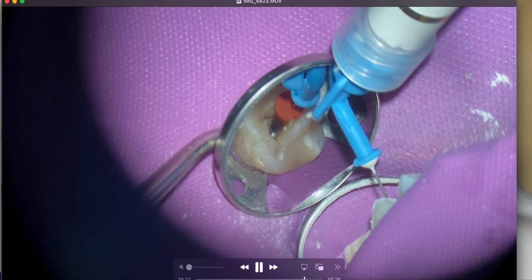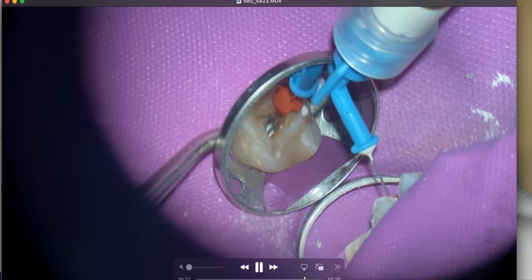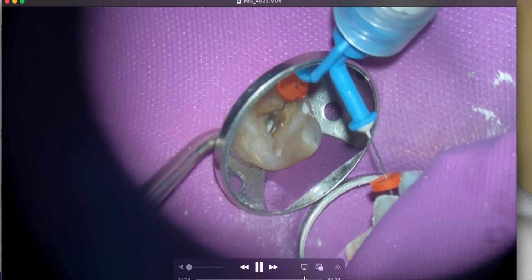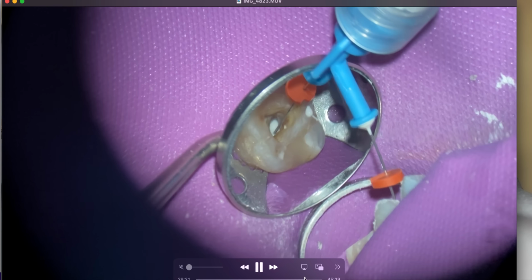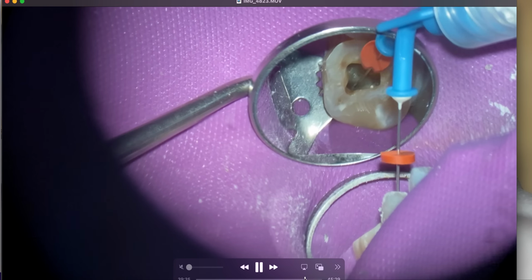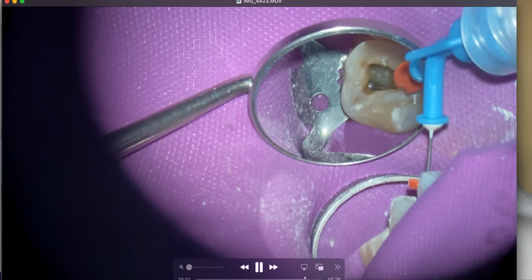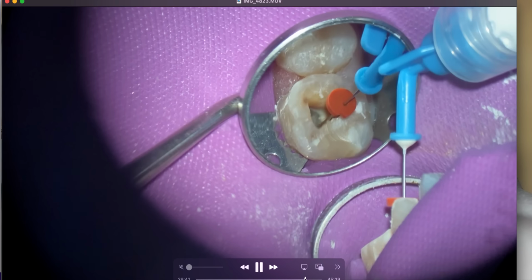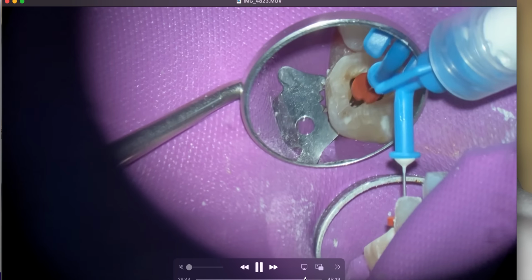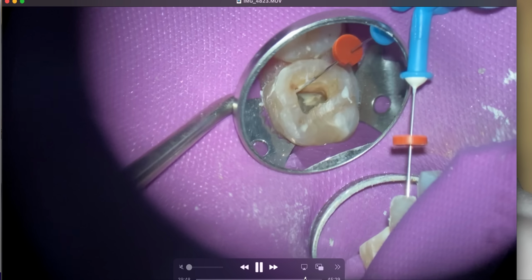It's set for 16 mils. So this way I can see that I'm completely filling without any voids. Now, does it really matter? No, it doesn't. I have a number of cases where calcium hydroxide is not completely full all the way to the apex, and it's just taken down with a file, and we have great resolution. So that went to working length, in the distal buccal and in the mesial buccal.